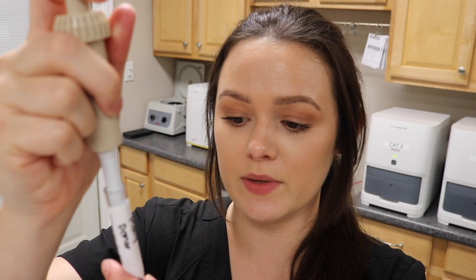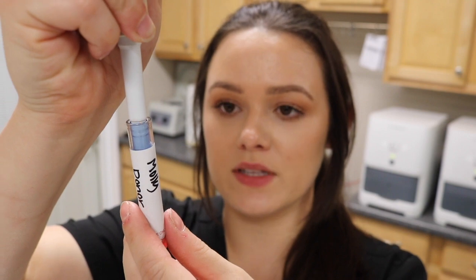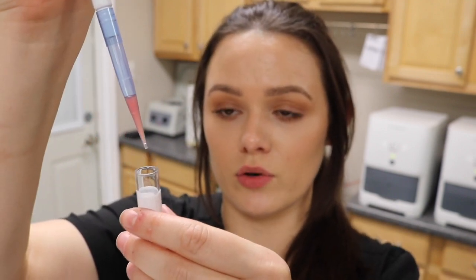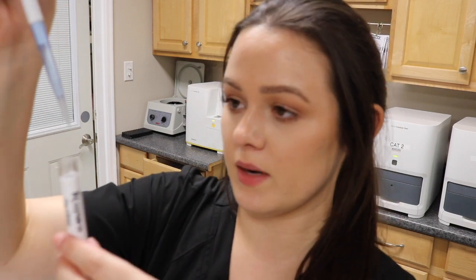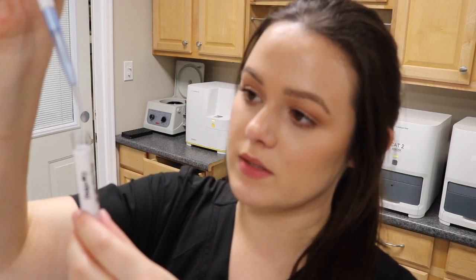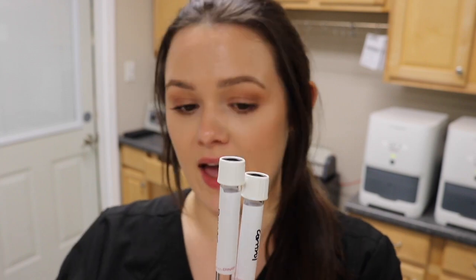For the controls, I'll take two drops of the donor's cell suspension mixed with two drops of the donor's serum for the donor control. Then I'll take two drops of the recipient's cell suspension and two drops of the recipient's serum for the recipient control. I now have four tubes: minor cross-match, major cross-match, donor control, and recipient control. I'll let these sit for 30 minutes at room temperature, then centrifuge all four for one minute.